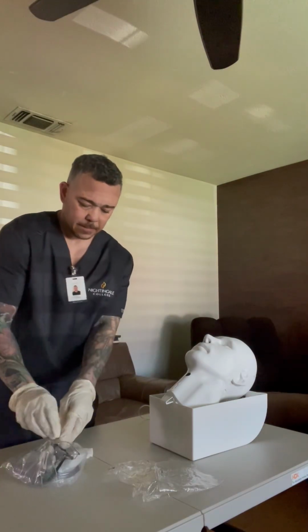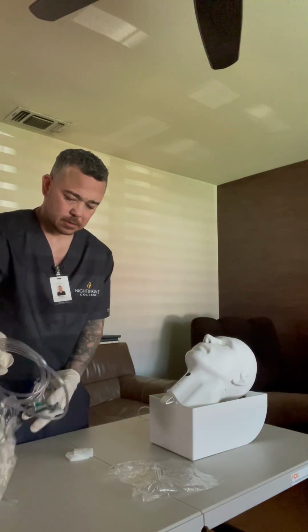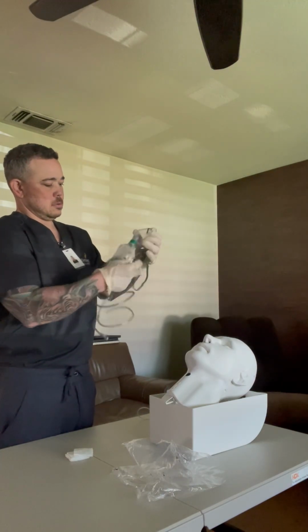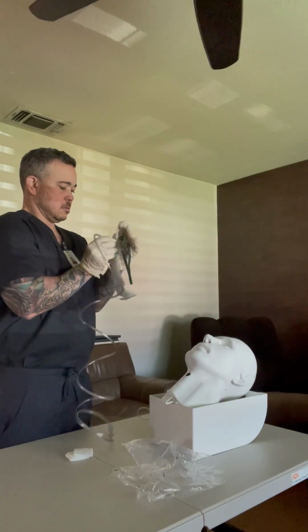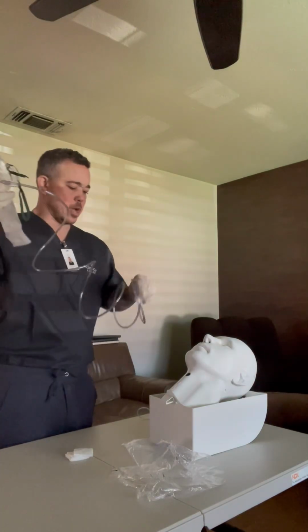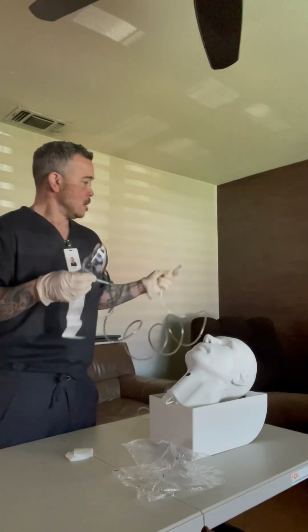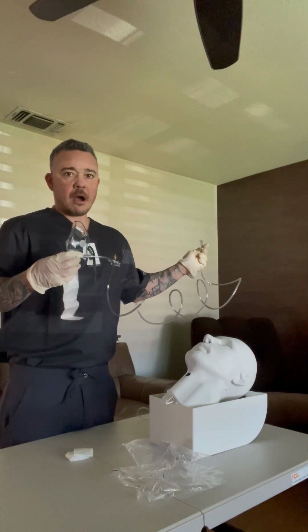The next thing, now we're going to go ahead and get the non-rebreather mask, okay? These will go in the proper receptacle, okay? So this portion here, the bottom here, is going to go onto the flow meter like how it was with the nasal cannula as well. So we're going to put this on the flow meter. We're going to make sure it's on the green dial, which is the oxygen dial, okay?